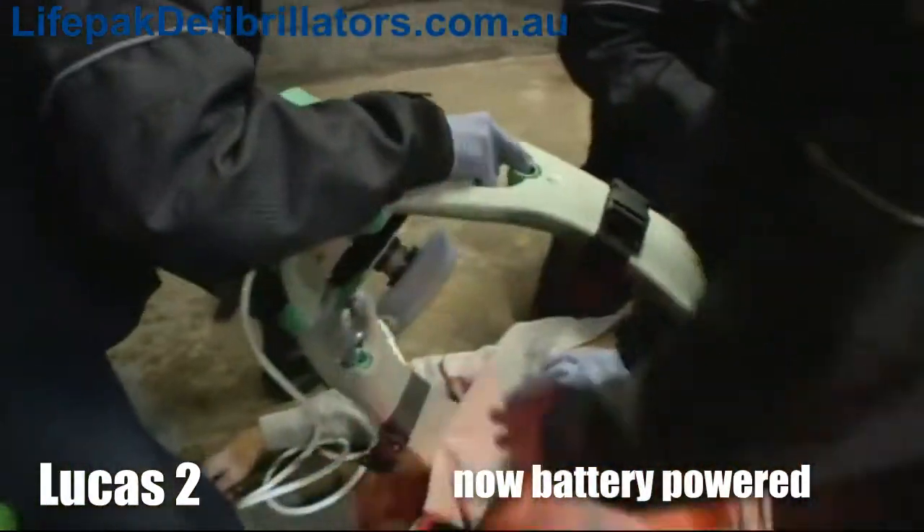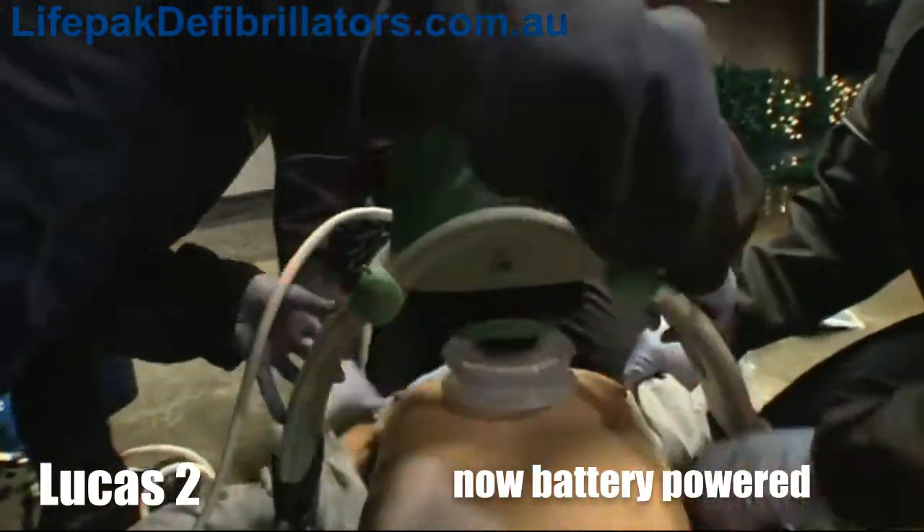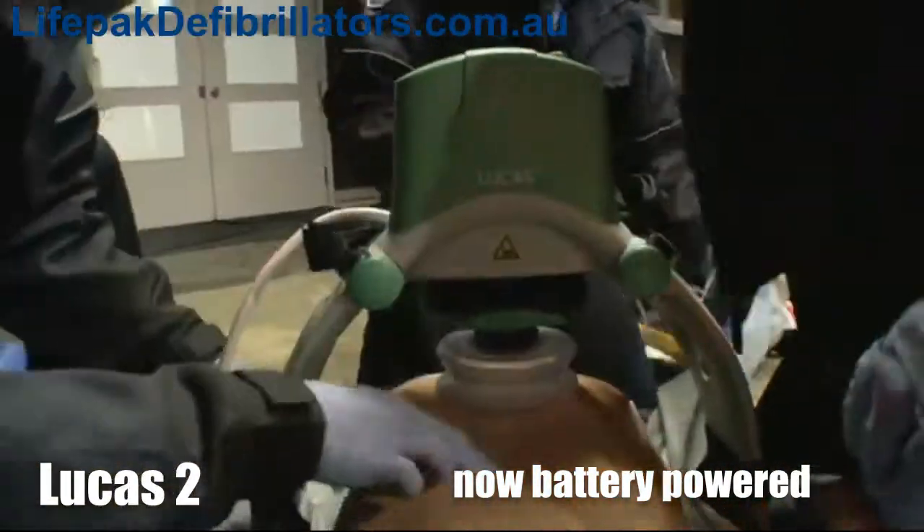After the backplate is placed under the patient, it takes less than 20 seconds to stop manual compressions, connect the upper part of Lucas, and start mechanical compressions.